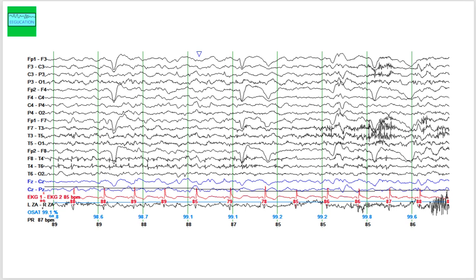Let's start with this very first page. You have to ask the question: what do you see here? First question is, is this patient awake or asleep? If you look carefully, you can see these eye blink artifacts. When you see eye blink artifacts along with some muscle artifact, this person is awake.